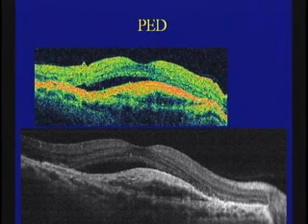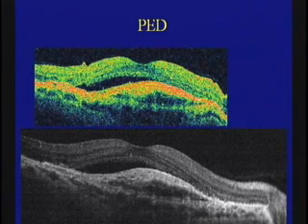And is that a serous detachment? Is there fluid in there? Correct. Those are areas of fluid underneath the pigment layer and underneath the retina. And prior to OCT, we would get a fluorescein angiogram, and the fluorescein would show us leakage. And we'd have to deduce from looking at stereofluoresceins what area had the fluid. So we would see some subretinal fluid, and then we'd see areas where the RPE is elevated in 3 dimensions. And now, as you can see in the OCT, you can see that with one cut, the area of RPE elevation and the fluid underneath the retina.